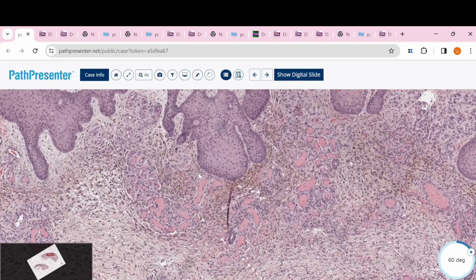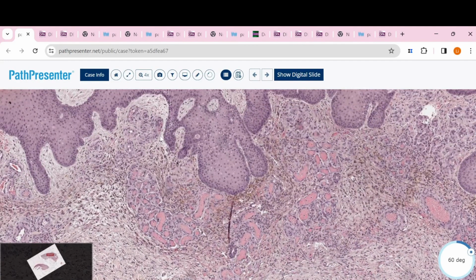the patient feels itching or any discomfort, they will scratch their skin, and then some vessels may just break, and the red blood cells go out, so we can see some red blood cell extravasation. But in a chronic lesion, just like this, we can see tons of hemosiderin deposition here. So this is all not melanin. This is hemosiderin from the red blood cell deposition here.